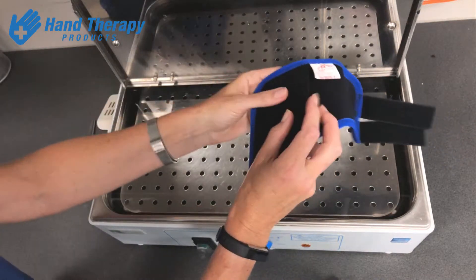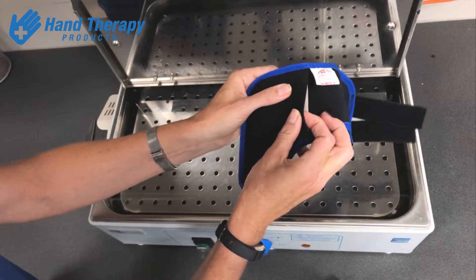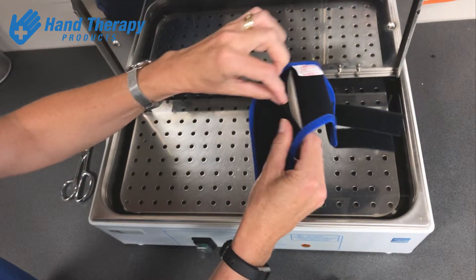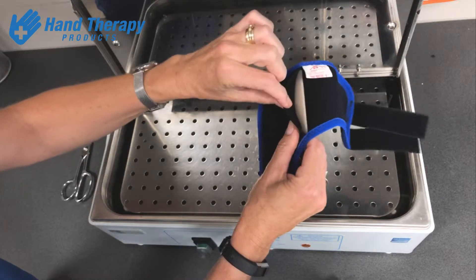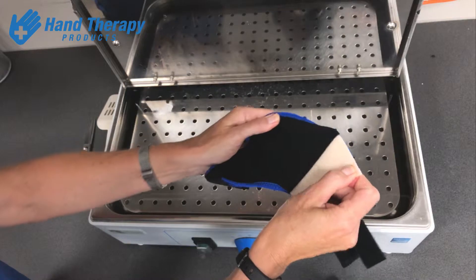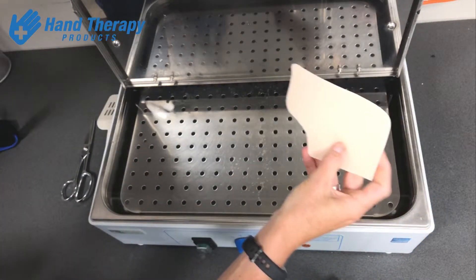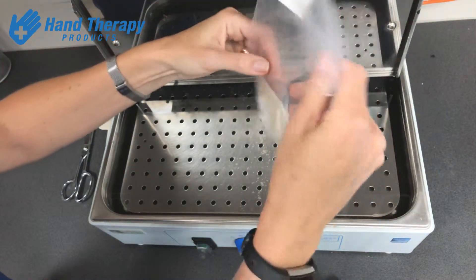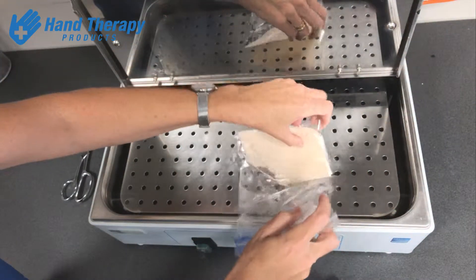What tends to happen though is that the plastic actually sticks to the neoprene, which does give a nice secure fit, but if you want to remodel it at any time you can't then remove the plastic. So my little tip is that I take that plastic out and slip it into a little plastic bag and heat it in that.